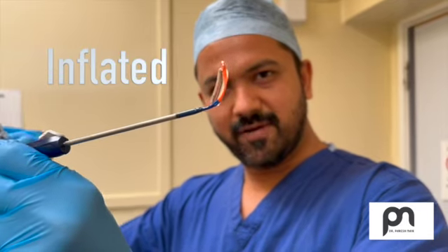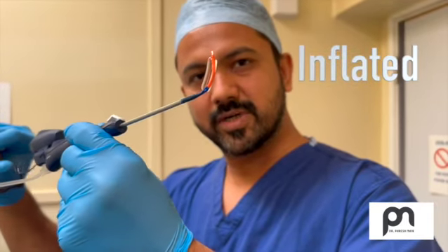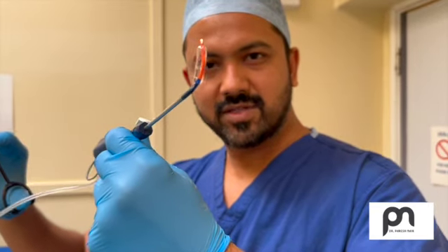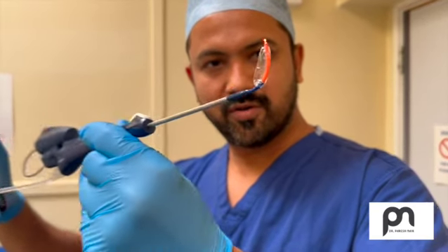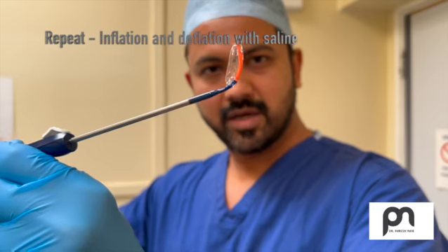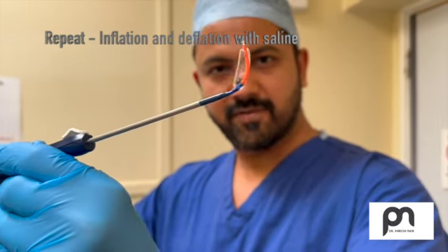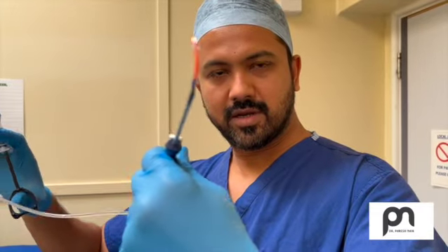This balloon is inflated and we keep it there for at least 2 minutes. 2 minutes is an ideal time. And once you're done, it deflates. I'll show you again. Inflation, deflation. Okay, take it gently, carefully.